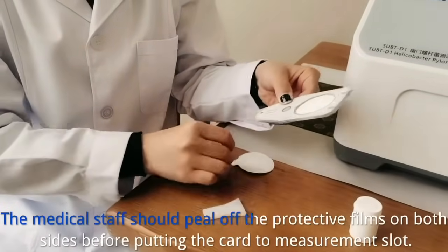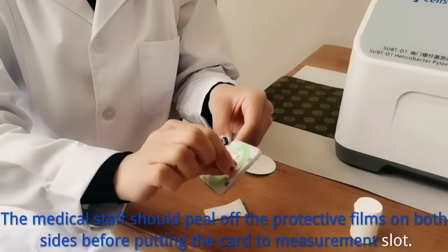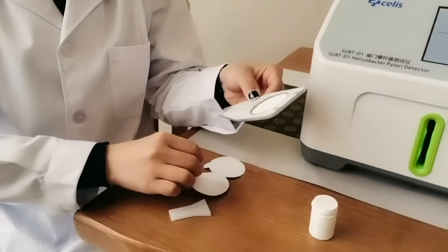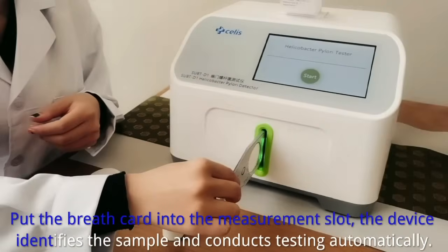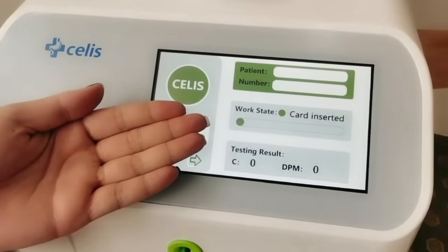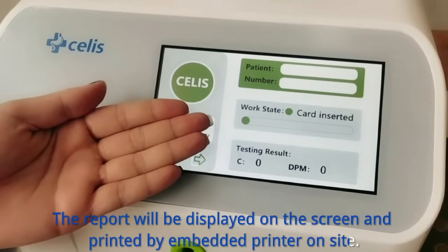The medical staff should peel off the protective films on both sides before putting the card into the measurement slot. The device identifies the sample and conducts testing automatically. The report will be displayed on the screen and printed by the embedded printer on site.